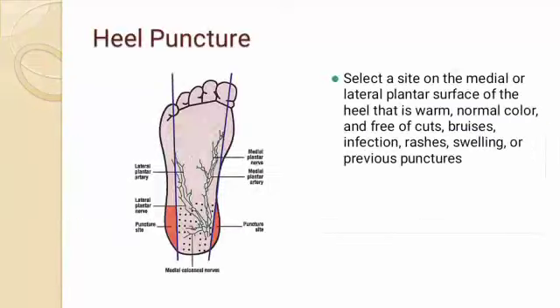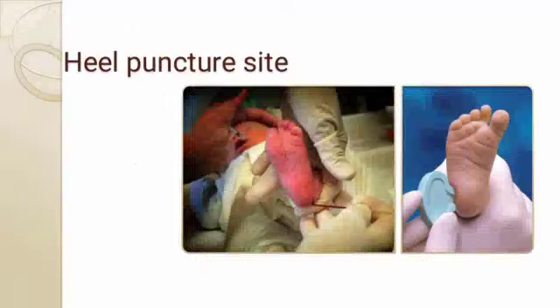Heel puncture. In heel puncture, select a site on the medial or lateral plantar surface of the heel that is warm, normal color and free of cuts, bruises, infections, rashes, swelling or previous puncture. Heel puncture sites in infants.